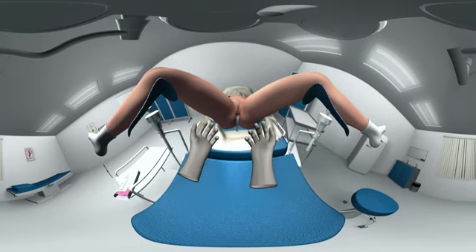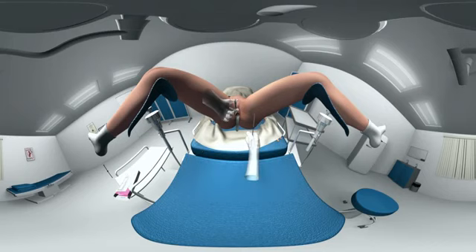Step 1. Wear sterile gloves. Grasp the upper lip of the cervix. Make a gentle traction on the holding forceps to align the cervical canal with the uterine cavity. Step 2. Set the upper edge of the flange to the depth measured during the uterine sounding.